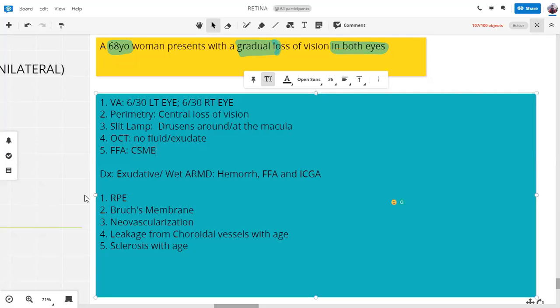What are you saying? Say it again. In those cases there will not be gradual loss anyway. There will not be gradual loss, there will be sudden loss. Secondly, these are investigations to aid or confirm our diagnosis. The classification of clinically significant macular edema and diabetic maculopathy was done on the basis of FFA. Remember, there is focal exudative, diffuse exudative, and ischemic maculopathy. We saw all that on our fundus fluorescein angiography. So CSME is ruled out in this case.